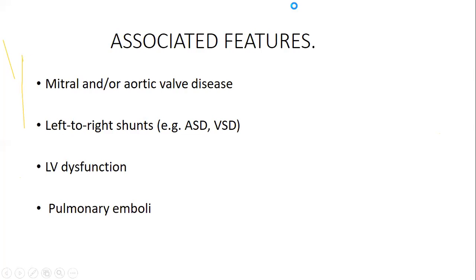So we need to work as a team, as cardiac sonographers, radiographers, and those of us who are practicing echo, with all those who are referring patients to us, so that the full potential of cardiac ultrasound can be realized. And also it's very important that as we do our cases of pulmonary hypertension, we look at certain specific parameters. And even as we conclude, we should look at specific orientations of our cardiac ultrasound.